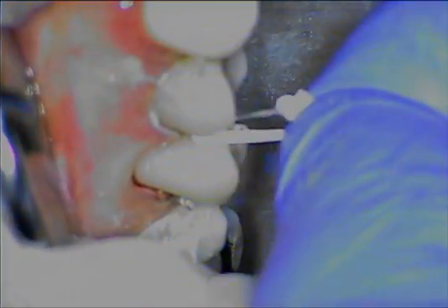We'll remove the Teflon and slip some floss down through according to standard techniques. In this case, Teflon was not applied to the molar because there was an amalgam adjacent to the restoration, so I was not worried about inadvertent bonding there.